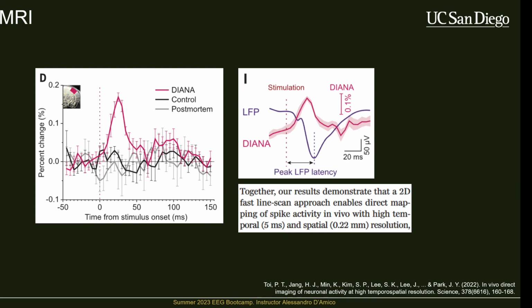One of my favorite dipoles is the eye. Sorry, she's an optometrist, so I wasn't expecting to tie optometry into this. But the eye is dipolar, so it has a difference in electrical charge from the front of it to the back of it towards the optic nerve. And that's actually activity that you can pick up.